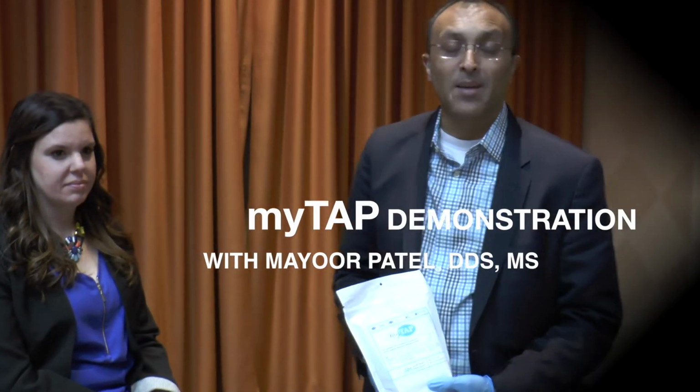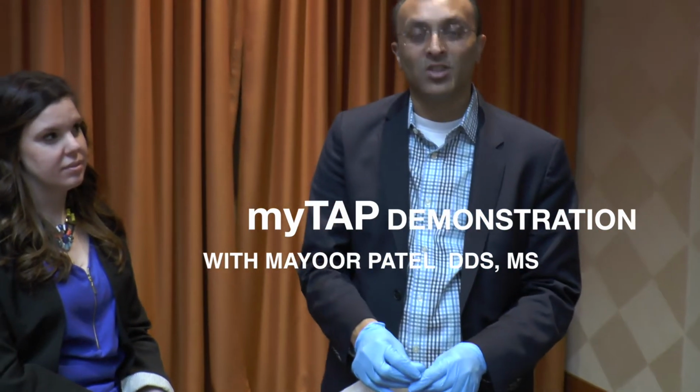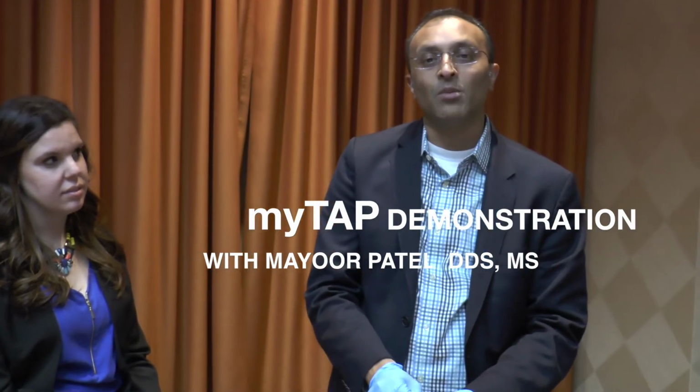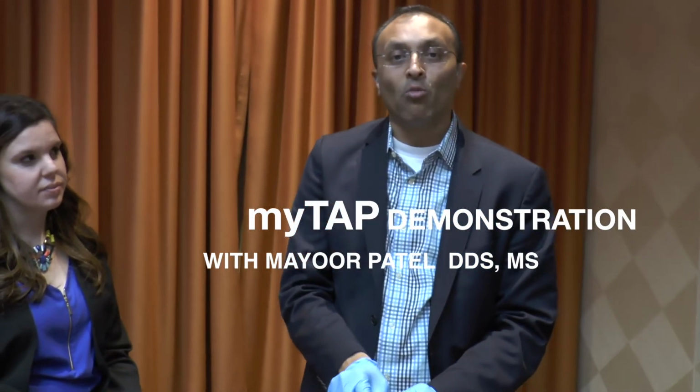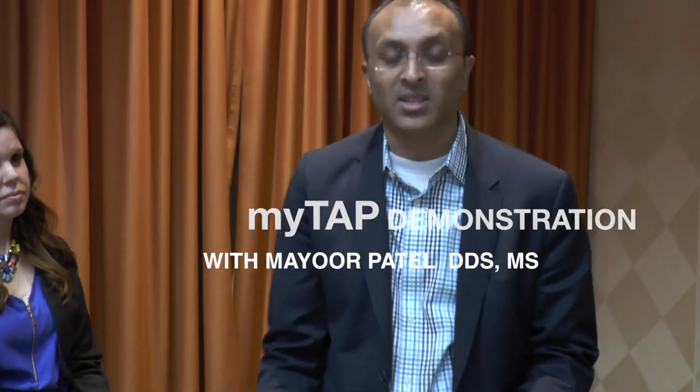What we're going to do is do a demonstration of using a myTAP device. The advantage of a myTAP device is that it can be used in several clinical applications. One in particular pertains to when patients are in doubt whether oral appliance therapy, specifically a custom device, would assist them or would facilitate their symptoms.